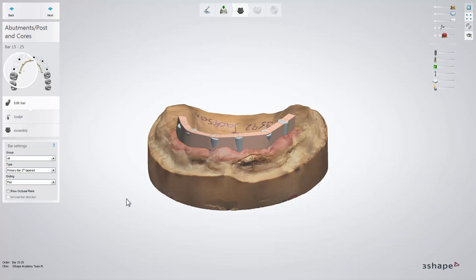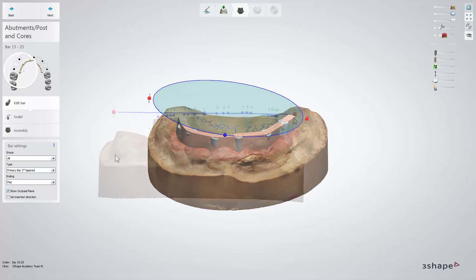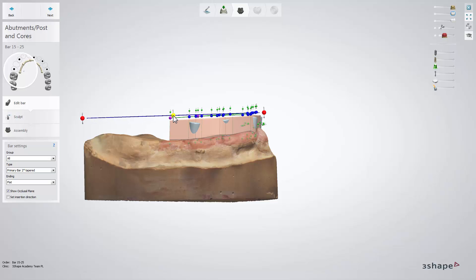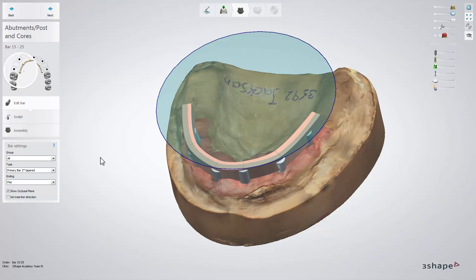To adjust the bar height, you can also use the show occlusal plane option, then right-click on a control point to move it to the occlusal plane or to move all of them together. At this step you also have the possibility to adjust the bar surface to the insertion direction.